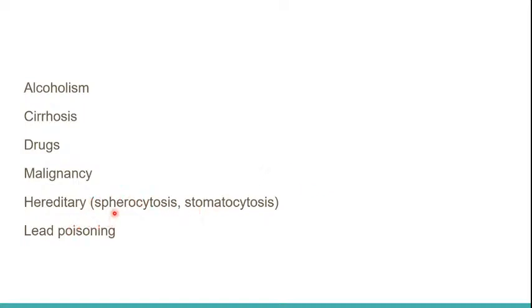Hereditary, of course, it's either hereditary spherocytosis or hereditary stomatocytosis. It could be either. You could see both of them in each of the disorders. Lead poisoning as well. All right.